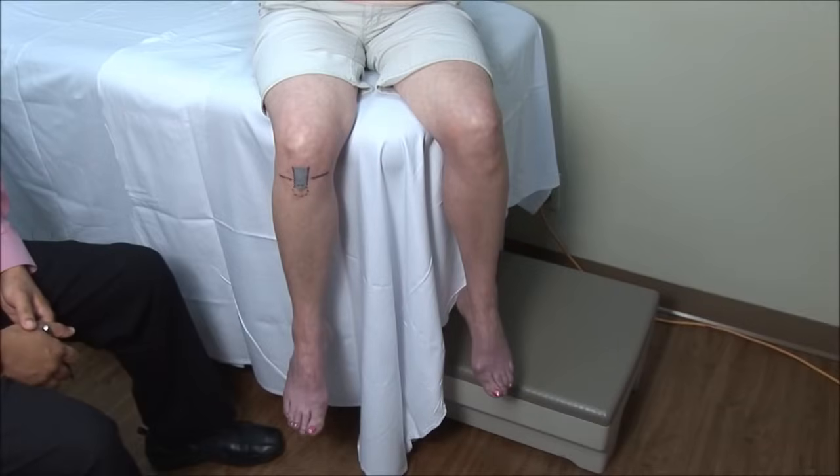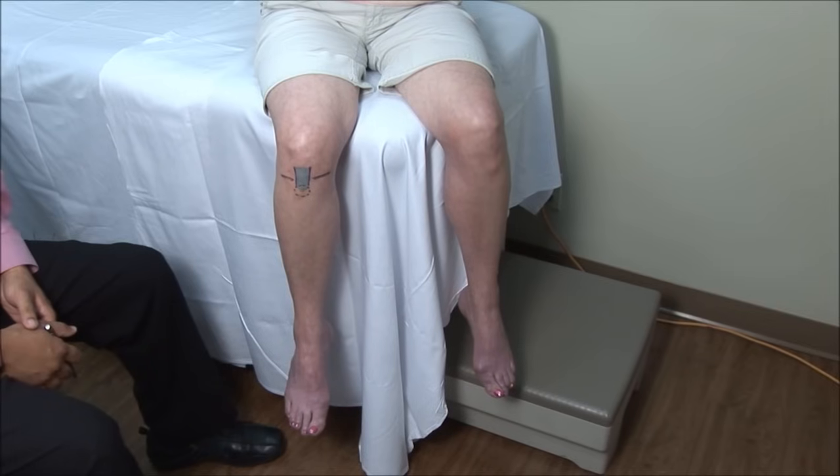Anterior injections are done with the patient sitting with the knee at 90 degrees and the lower leg hanging off the bed.